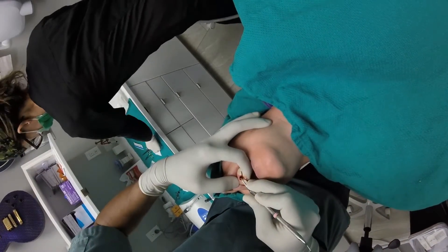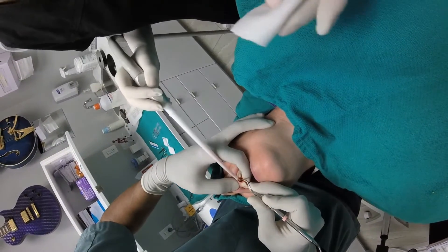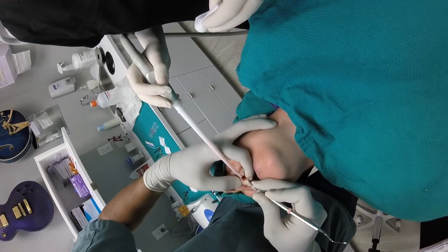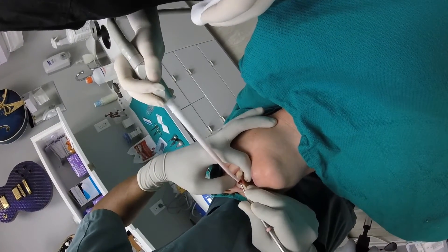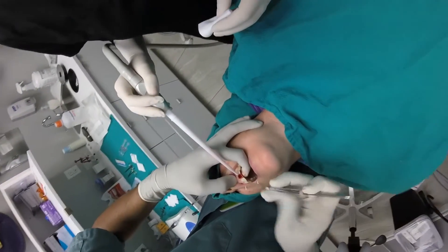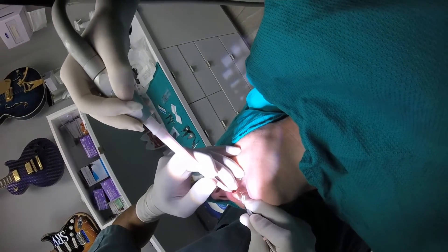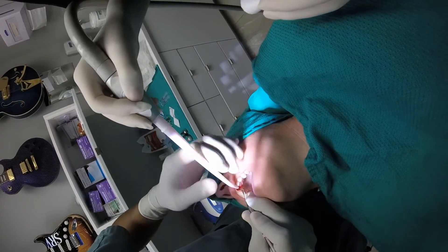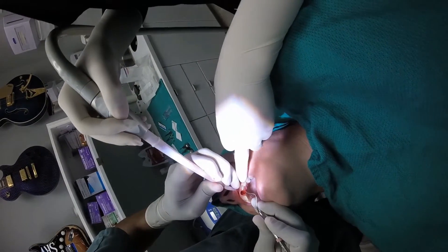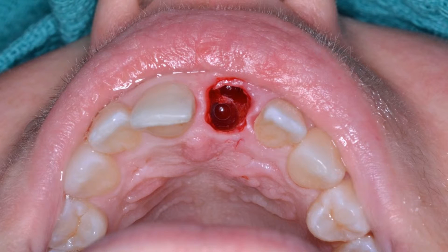Now I'm grabbing a curette and going back into the socket. Just curette the socket out, make sure there's no tissue inside there, and make sure there are no remnants left over from the endodontic procedure that had taken place. You're also assessing that buccal plate to make sure it's not fractured, so that one can facilitate the placement of an immediate dental implant into that dense palatal bone. One can see in this photograph the osteotomy that had taken place using the twist drills to place the dental implant into that dense palatal bone.